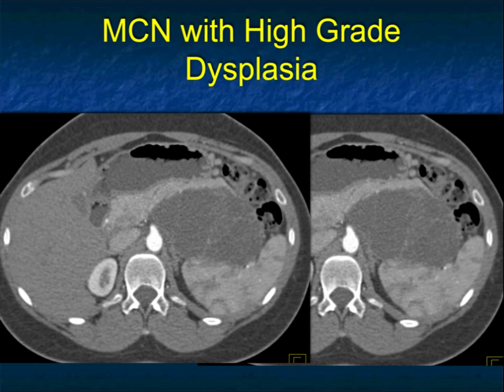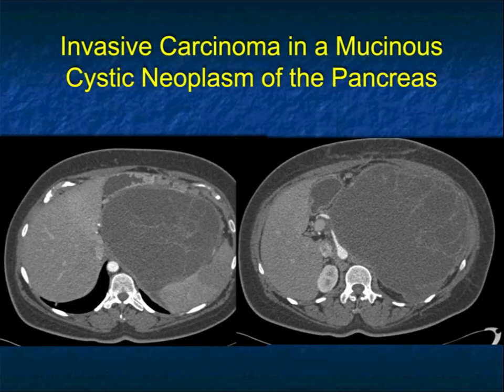Based on size, you would have worried about it. At PATH, this had high-grade dysplasia. So doing a distal pancreatectomy was indeed the right thing. Here's another case.